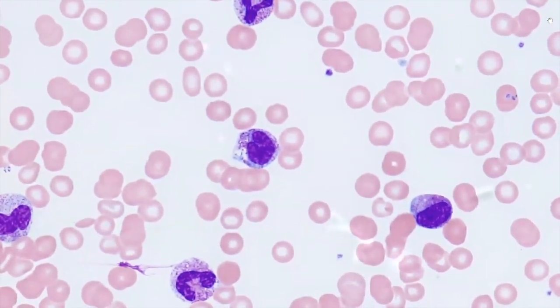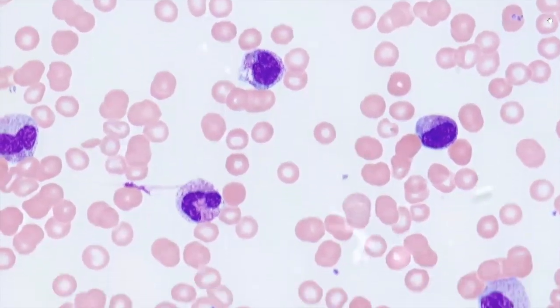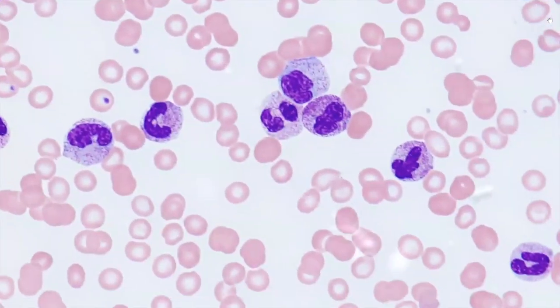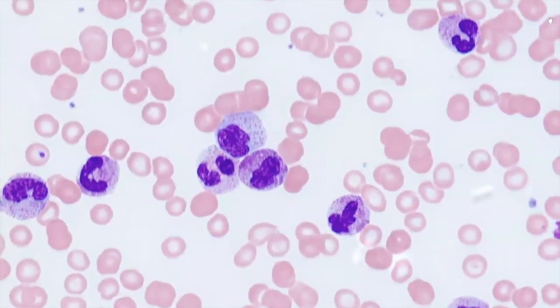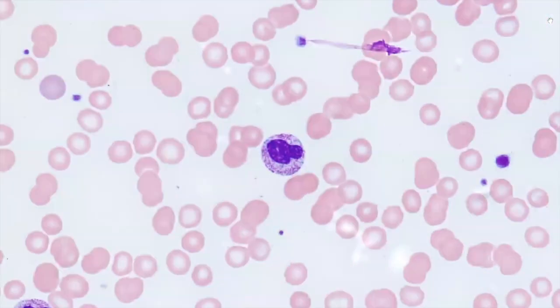And left shift refers to the neutrophil lineage when it's laid out on a piece of paper, with the left being the most immature forms and the right being the mature multilobated neutrophils. Some of these neutrophils have characteristic Döhle bodies which appear at the periphery of the neutrophil. Here is a good example of a Döhle body.